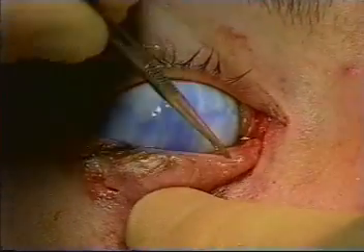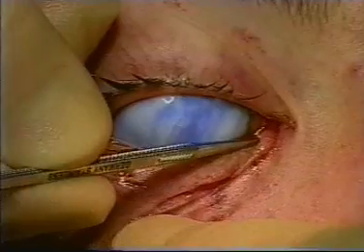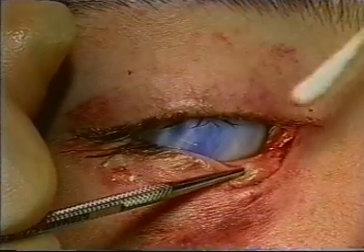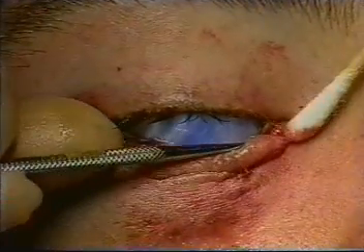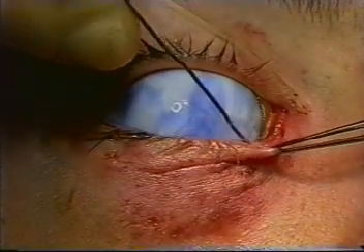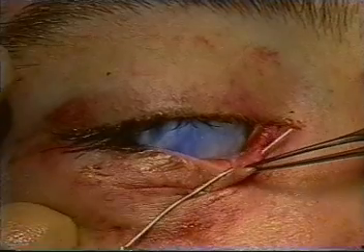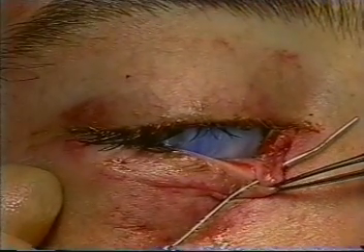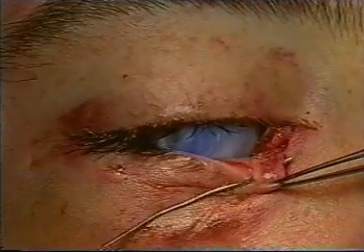The punctum is dilated using a punctal dilator. We can see that the punctal dilator is visible through the distal cut end of the canaliculus. Using a number 1 Bowman probe, the canaliculus is clearly shown to be lacerated approximately 3–4 mm from the punctum.